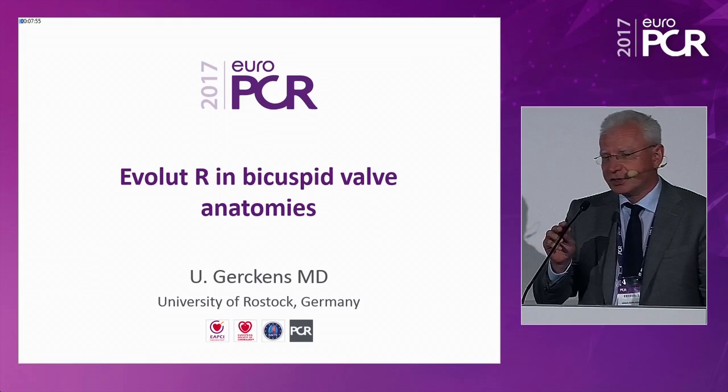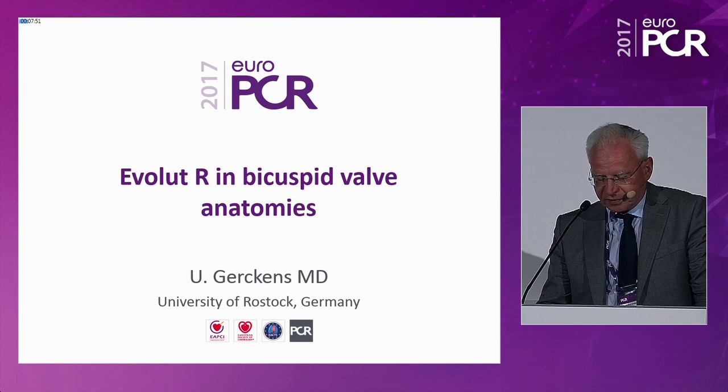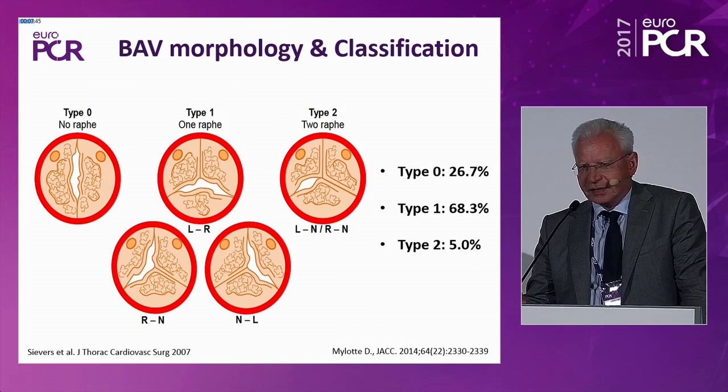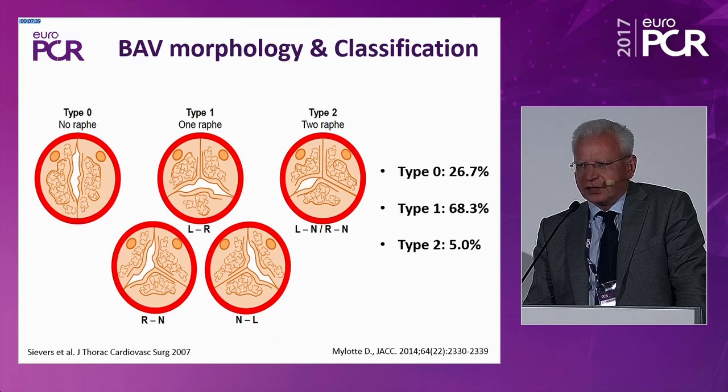Dear Sonia, dear Francesco, thank you very much for the kind invitation. Dear colleagues, I will try to step into the bicuspid valve anatomies, and I will make some points beforehand, discussing what we are facing, and then I will make a point of discussion with a case presentation, and that is very open for discussion and looking forward.